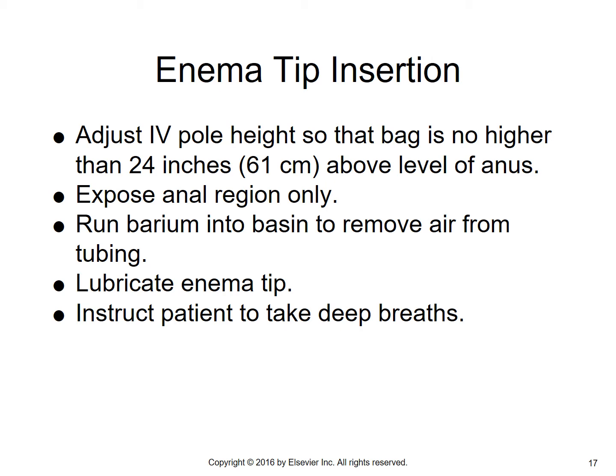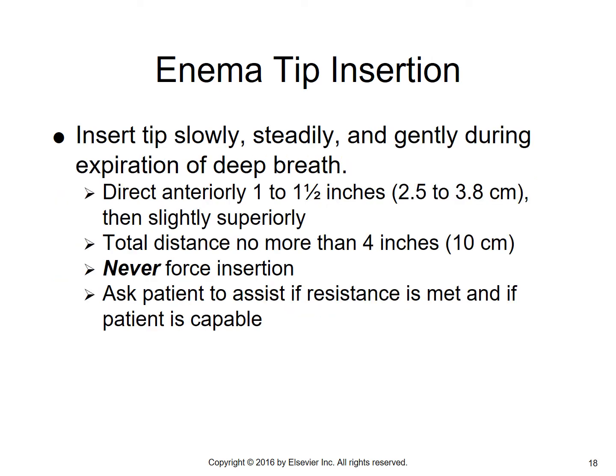And then you're going to instruct the patient to take deep breaths. It's very, very important that you insert the tip slowly, steadily, but gently during expiration of a deep breath. So you tell the patient, take in a deep breath, blow all the air out. As they blow the air out, you're going to start to insert the enema tip. You're going to direct it anteriorly, 1 to 1.5 inches, then slightly superiorly.